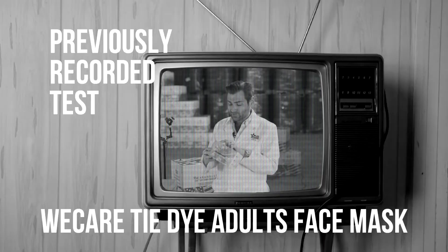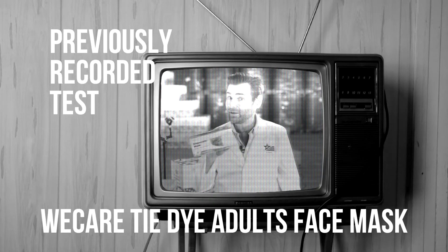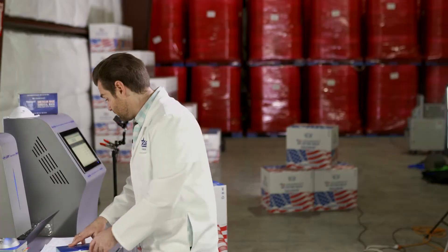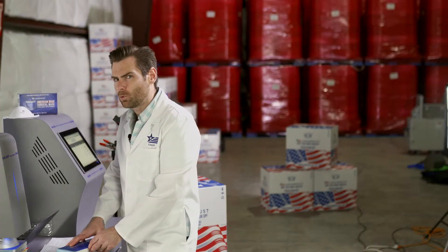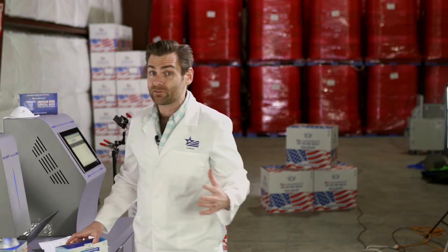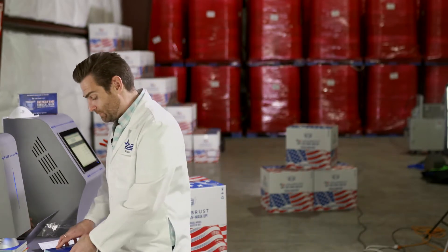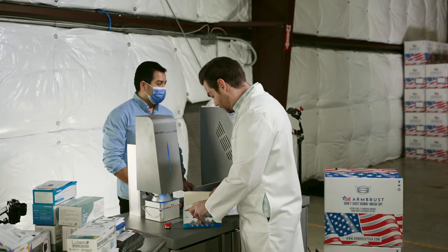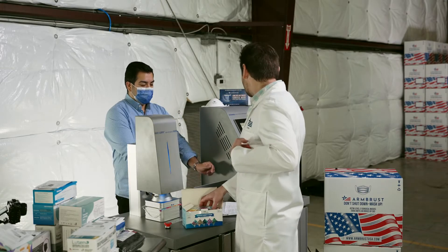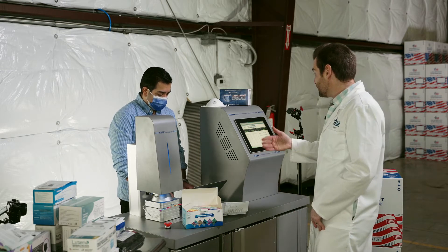These are effective, painless, and soft on the skin — no pain with this one. Now we're testing these, which are a dollar more, which is weird — the other ones were $19.98. We bought every mask on Amazon, so we're not messing around. This is a slightly different SKU, maybe an earlier one. Breathability is actually a lot worse: the other one was at 98 Pascals, this one is at 119 — that's about 20% worse.